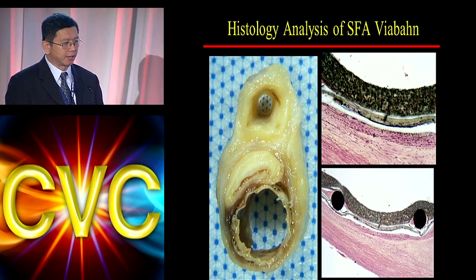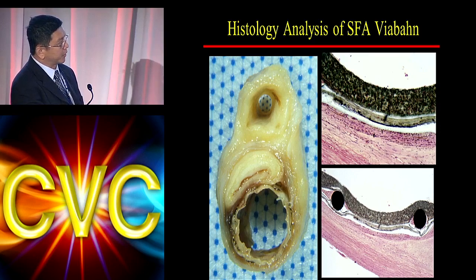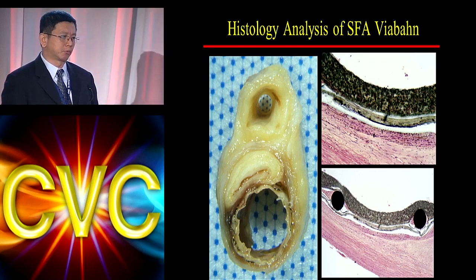the PTFE lining. And then from a histological standpoint, with long-term follow-up findings, if you were to look at a histological study up to 3-4 years later, the PTFE lining remained a blood-bearing barrier, separating the blood from contacting the atheromatous plaque, thereby minimizing the smooth muscle cell proliferation.